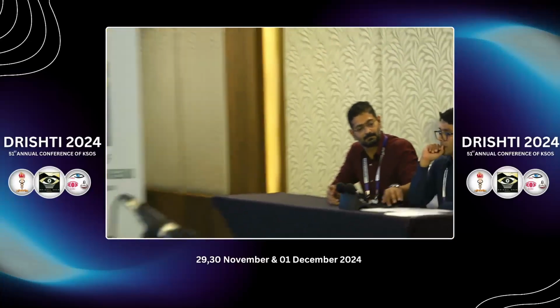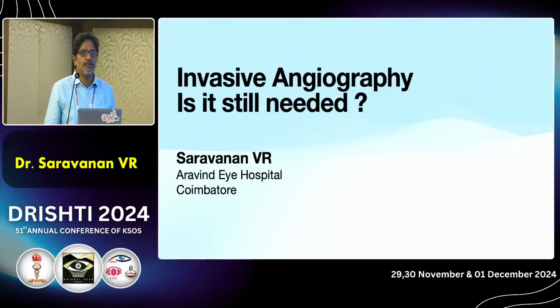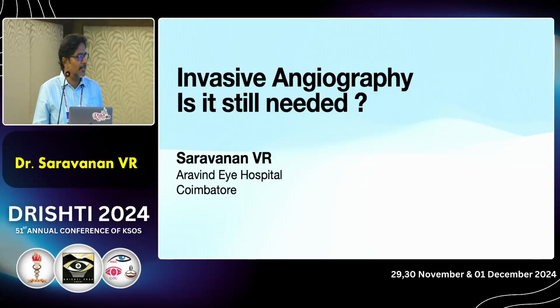Thanks, Sharath, for this opportunity. Right now, this question arises mainly because we have comfortable non-invasive procedures to evaluate disease progression as well as response to treatment, mainly the OCT and the OCT angiography. Otherwise, this question would not be asked whether we still need an invasive angiography.